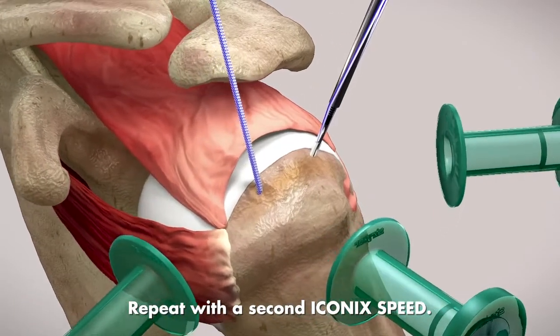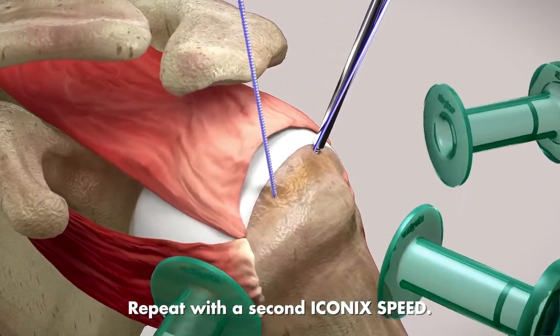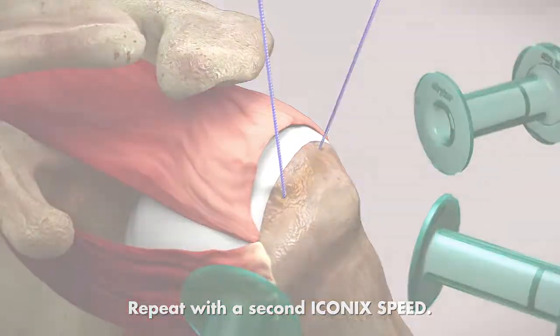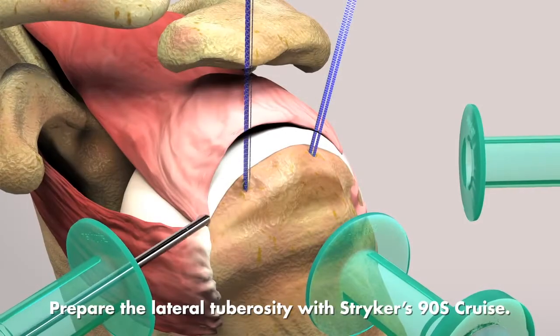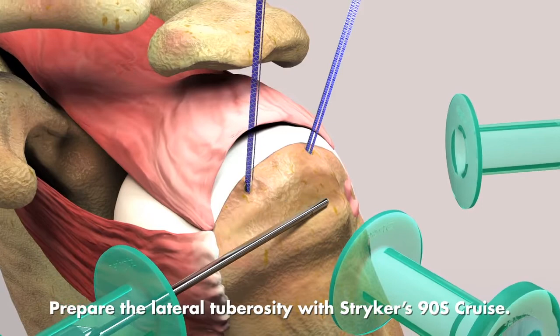Repeat with a second ICONIX SPEED. Prepare the lateral tuberosity with Stryker's 90S Cruise.